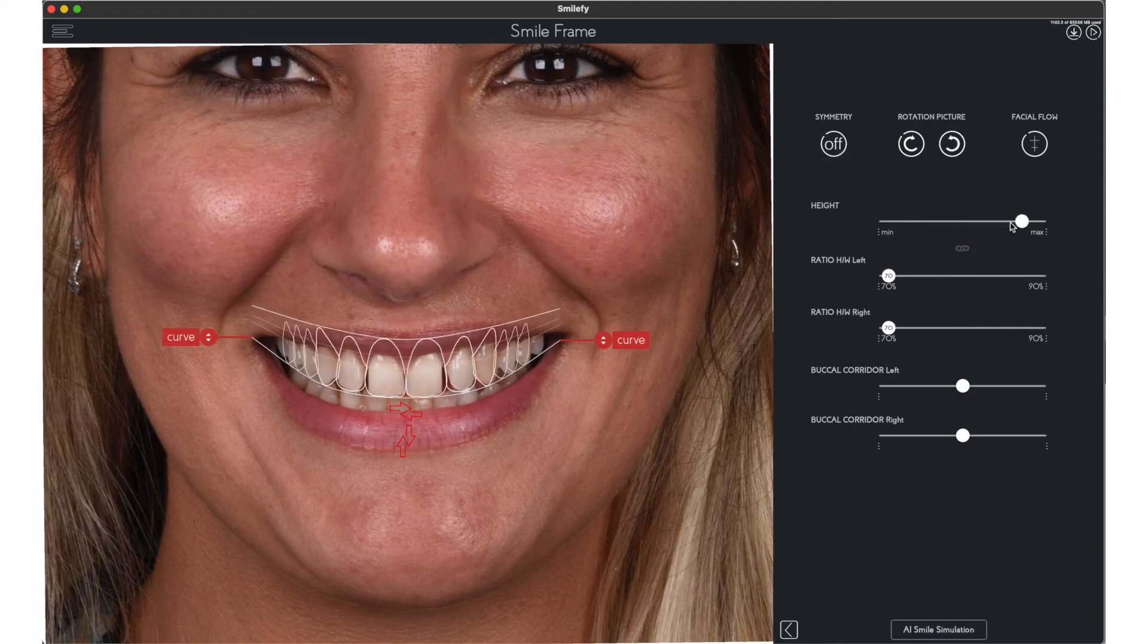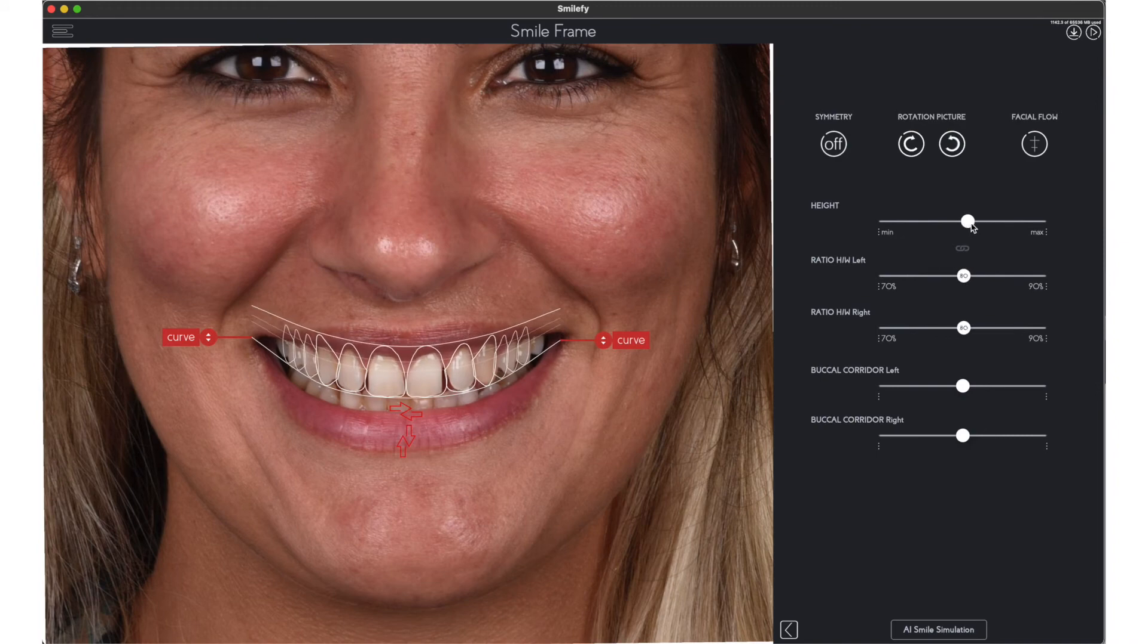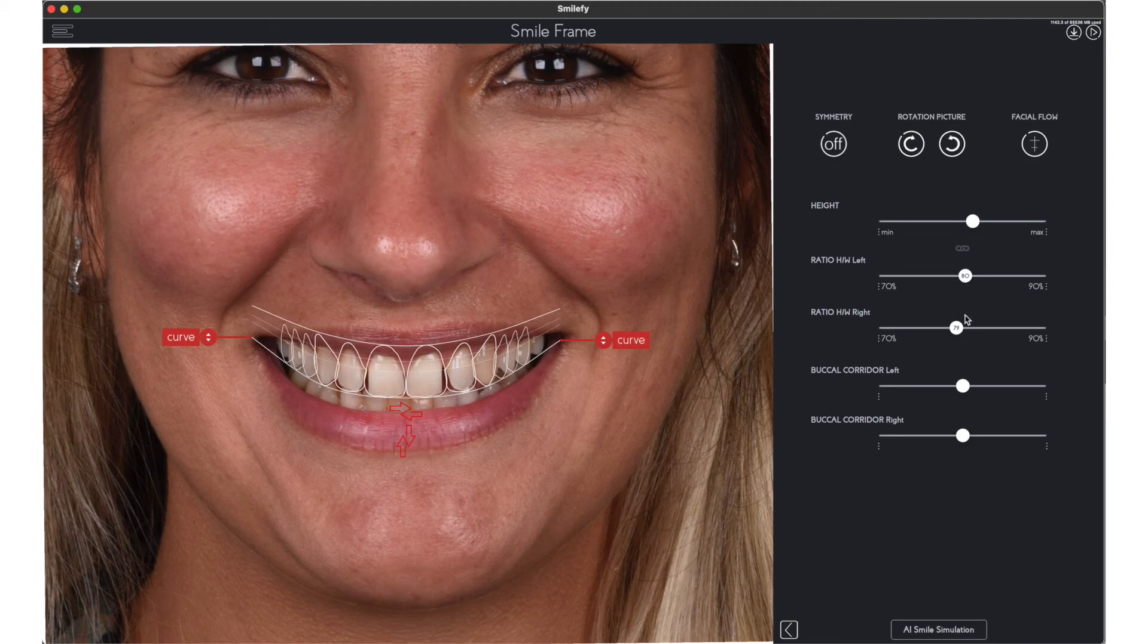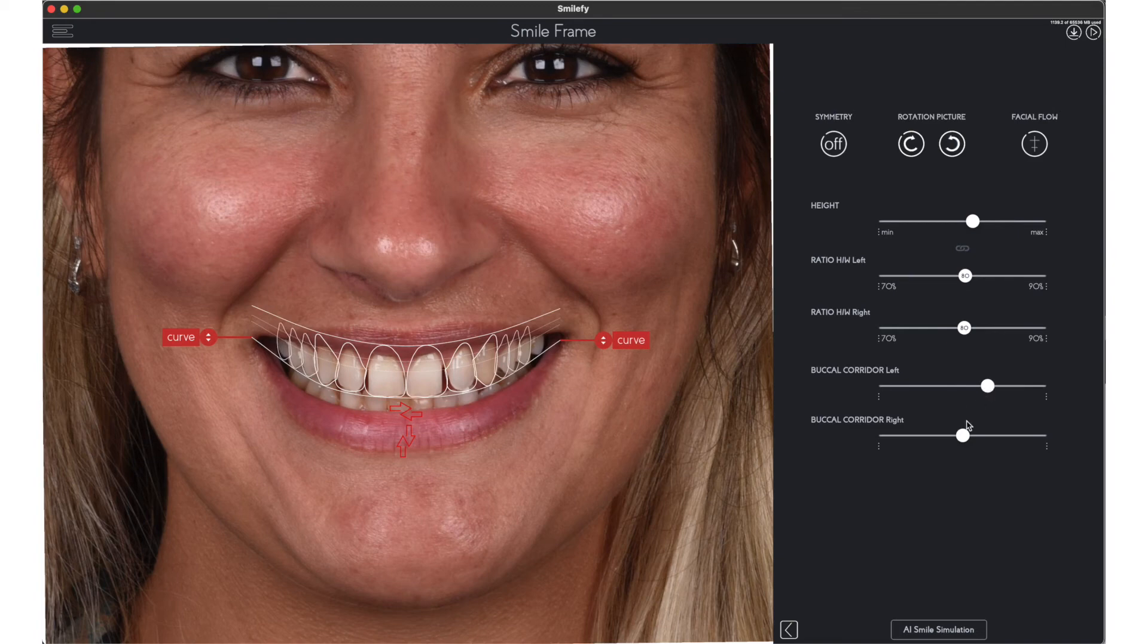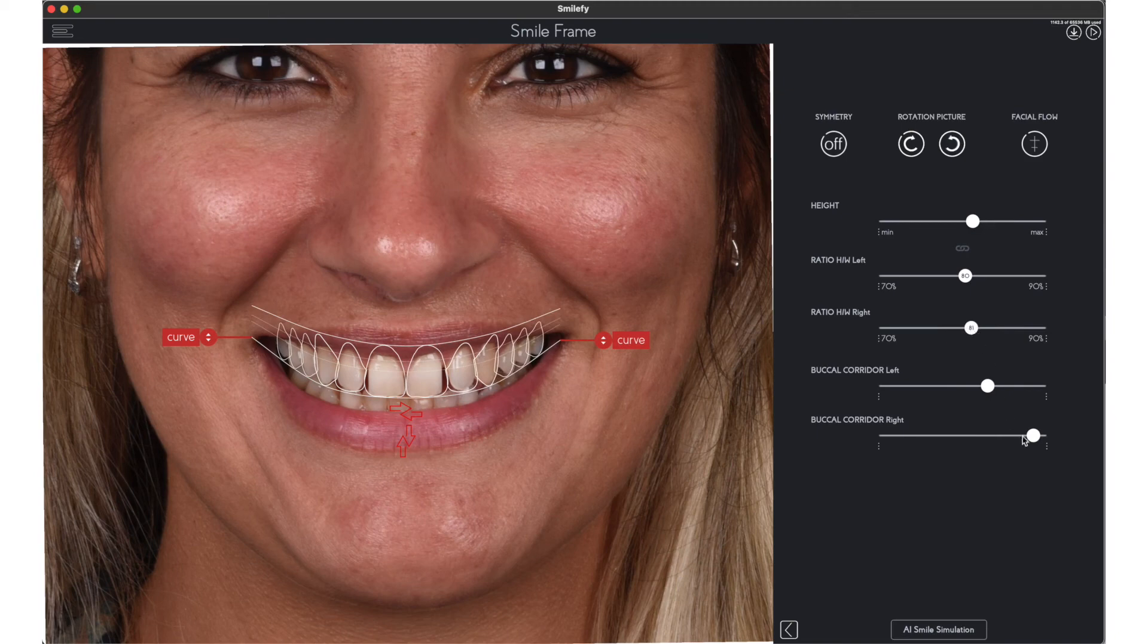Adjust the settings of the smile frame if needed. You can set the height of the templates, set the ratio, height of the central incisor and width, turn the symmetry off and adjust the left and right sides separately. Also the buccal corridor can be adjusted according to the patient facial characteristics.